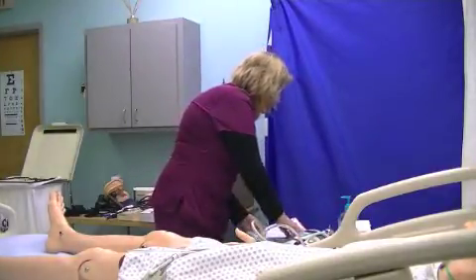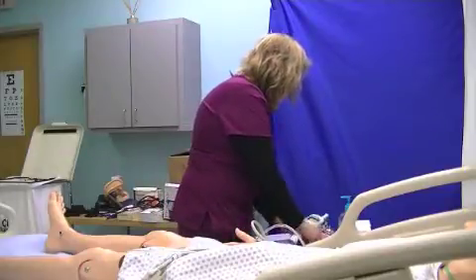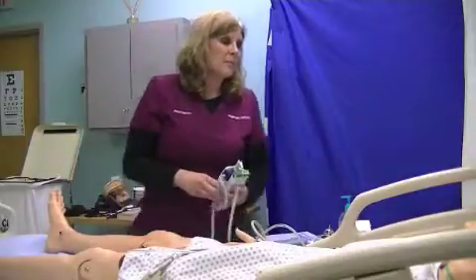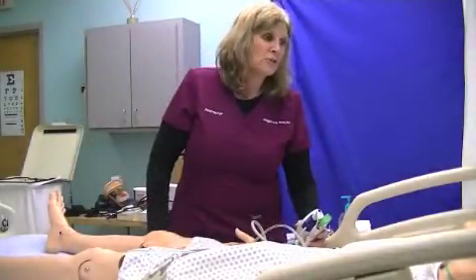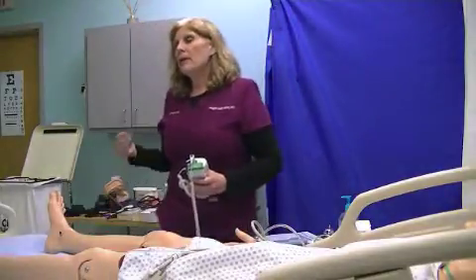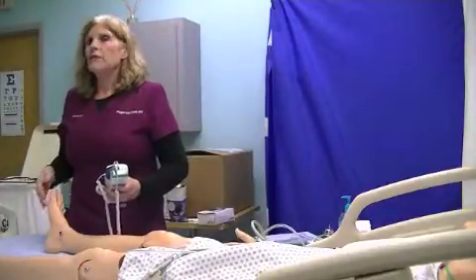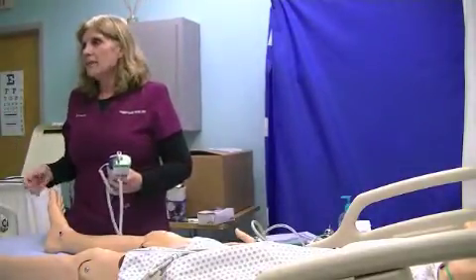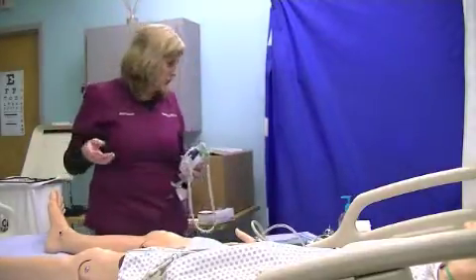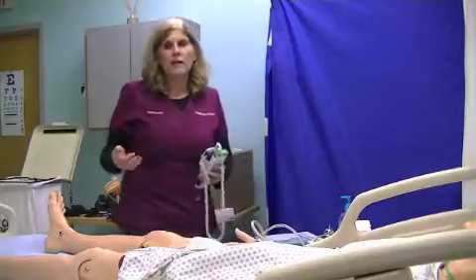So Mr. Pierce, we're going to take your oral temperature, and of course, because my patient is a mannequin, I'm going to do my own oral temperature. But I need to know to ask my patient, have you had anything to eat or drink in the last 20 to 30 minutes? Because if somebody had something cold to drink, that would lower the temperature. If they have something hot to drink, that would make the temperature elevated. So you want to make sure you get an accurate temperature. So you need to wait at least 20 to 30 minutes.